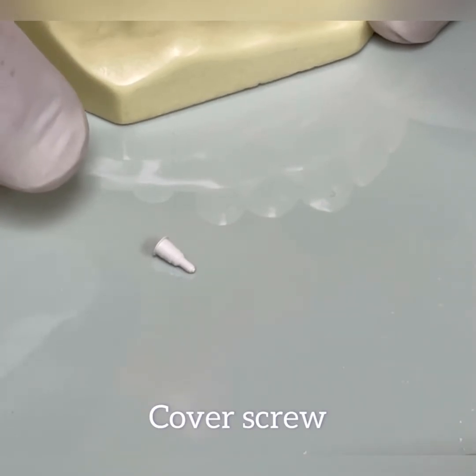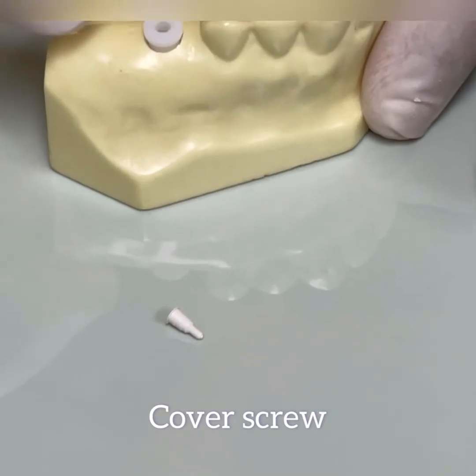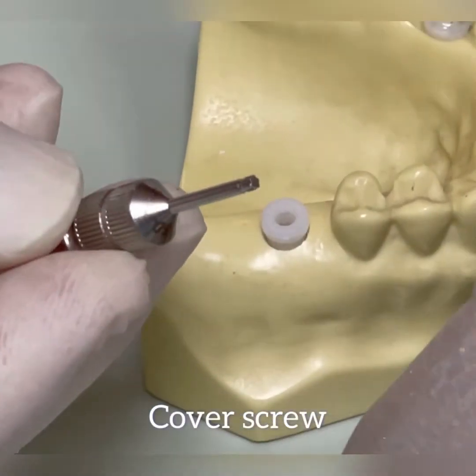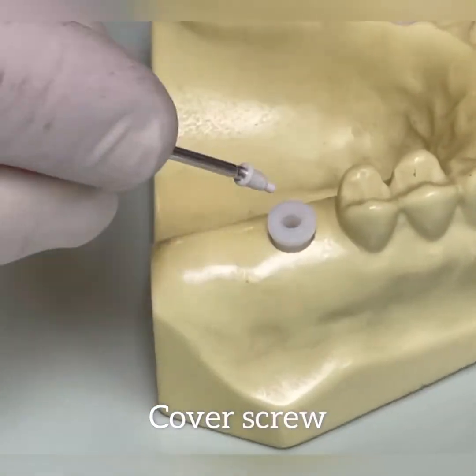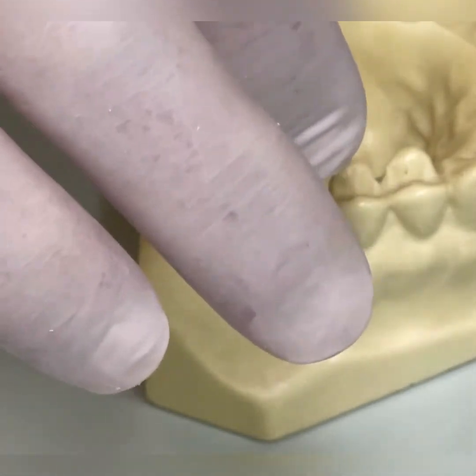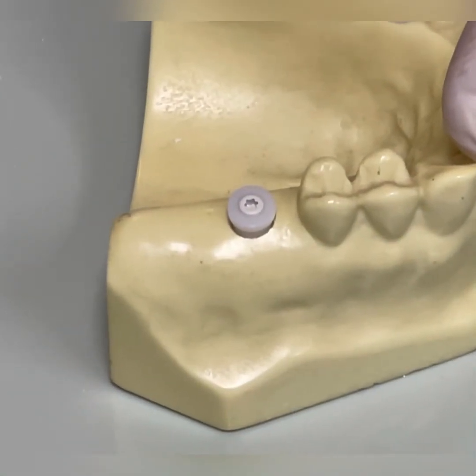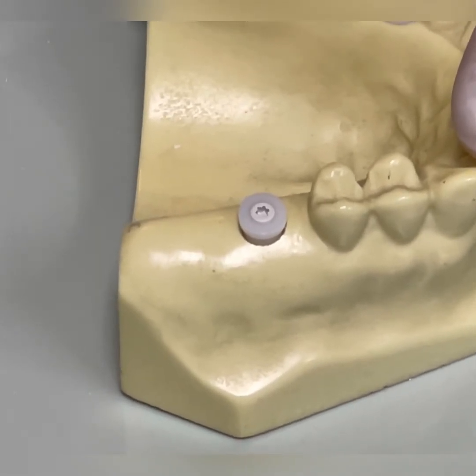Before we place any sutures, if there are any sutures involved, we have to cover the opening of the implant with a cover screw. This is the driver for that. Don't use too much force — just very light finger pressure and that's it. We want to be able to remove it. Healing time is four to six months, depending on bone type.